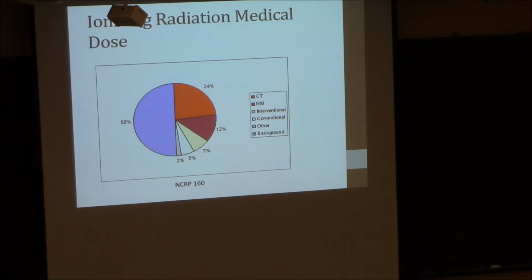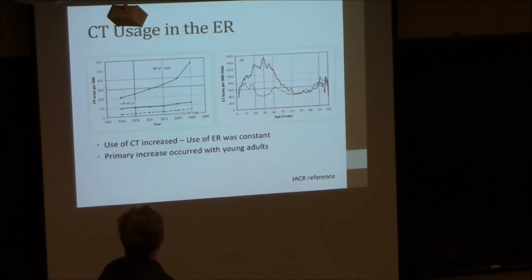They put a stent in a vessel, if you have a small aneurysm or a small hole, and they want to put a little tube in there to connect your two tubes together when they do their plumbing work. But they do it under guidance of X-ray, or fluoro guidance, which is like real-time X-ray. They turn it on and they just watch things happen. So that's what this is, and that's actually, in some sense, a little more concerning than this, but the reality is most of this was CT. So that's what started the push.